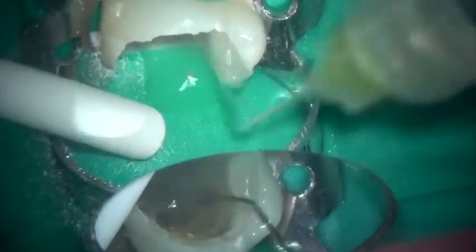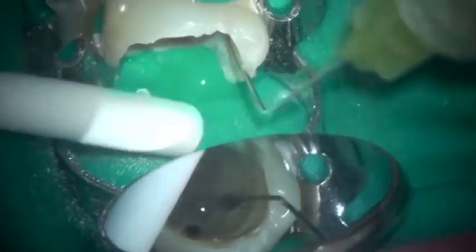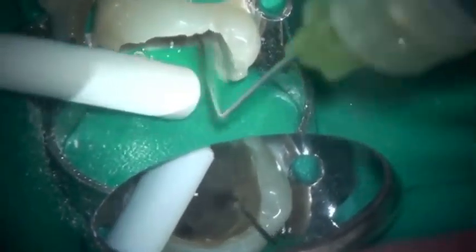Irrigating the root canal, I can then look under high magnification to ensure that I've got a good staging platform around the head of the instrument.